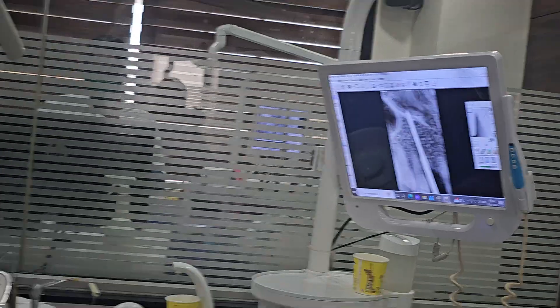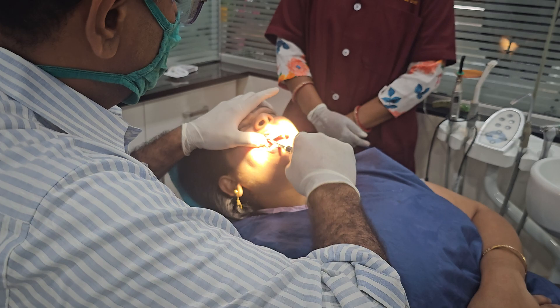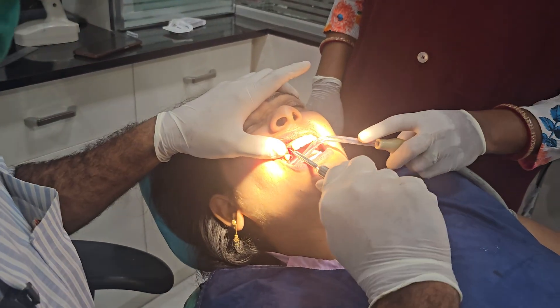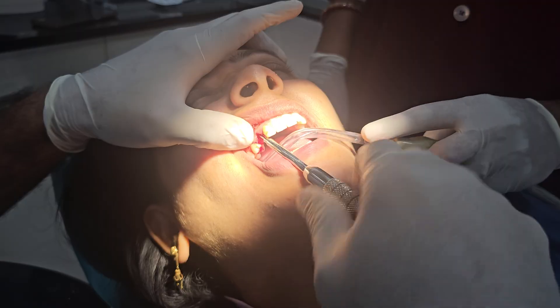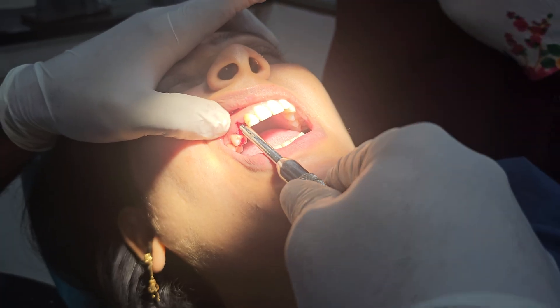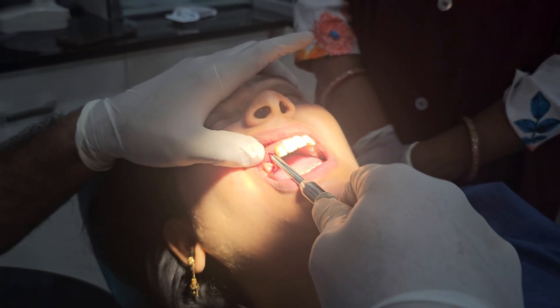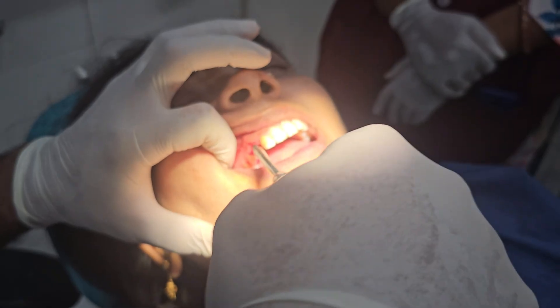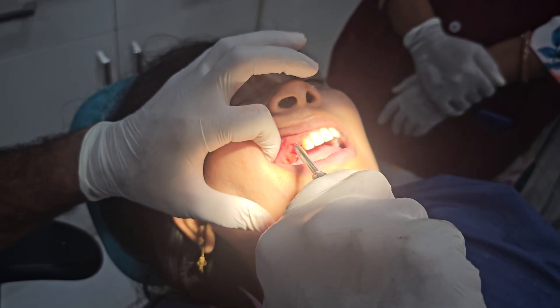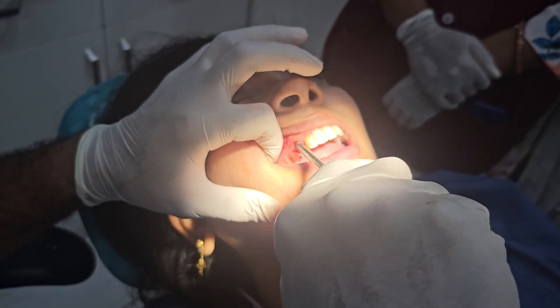Now we are going to place the implant. We have calculated the length of the implant. Now we are placing the implant and we are getting very good torque. We have done the osteotomy from buccal to palatal direction, and as you can see, I have got very good torque here.